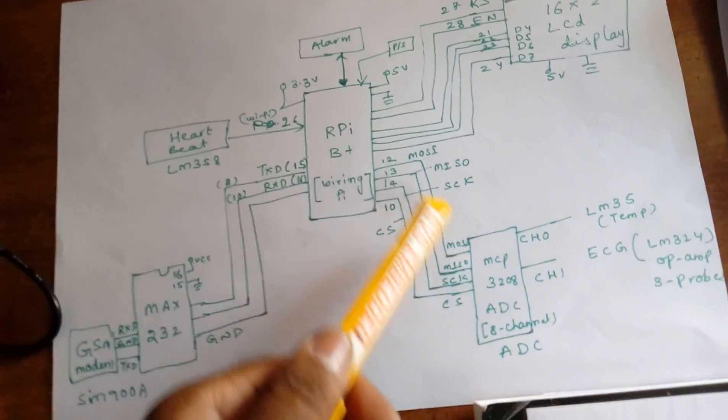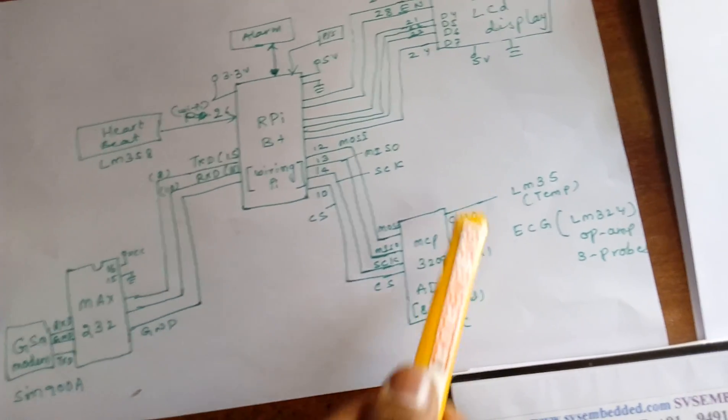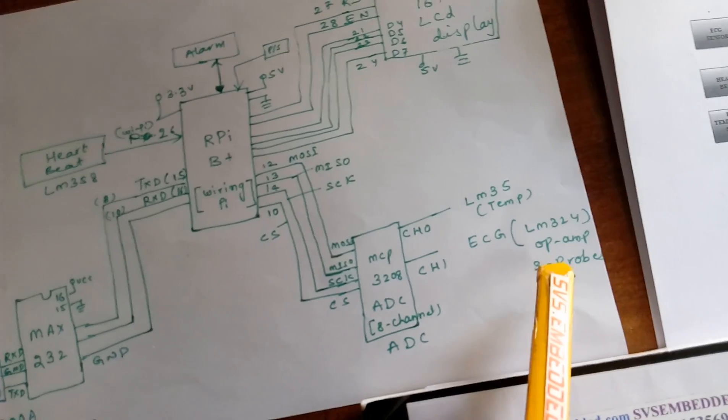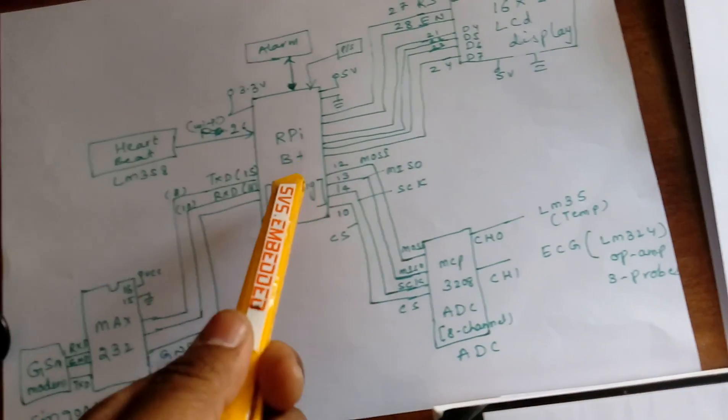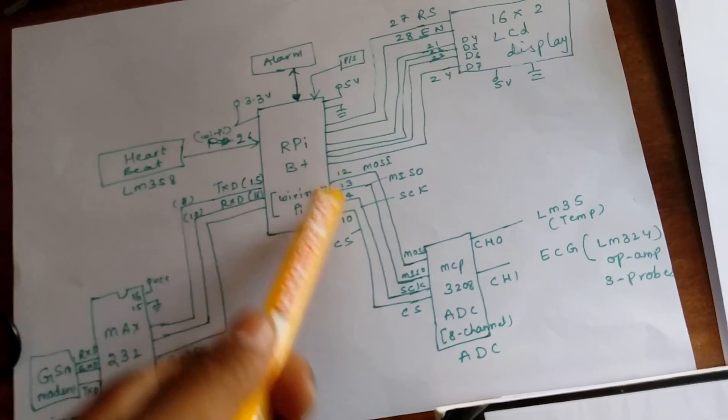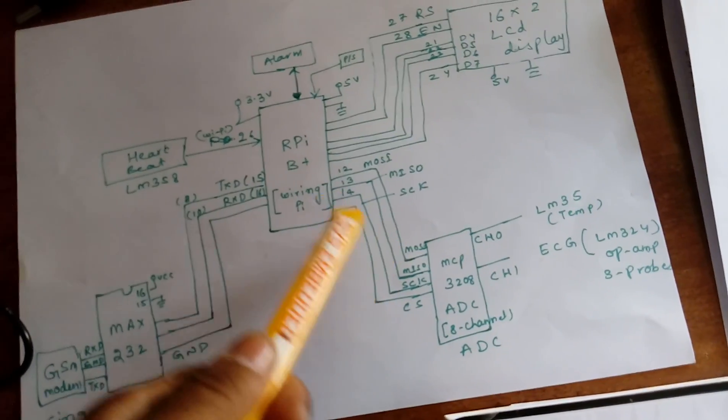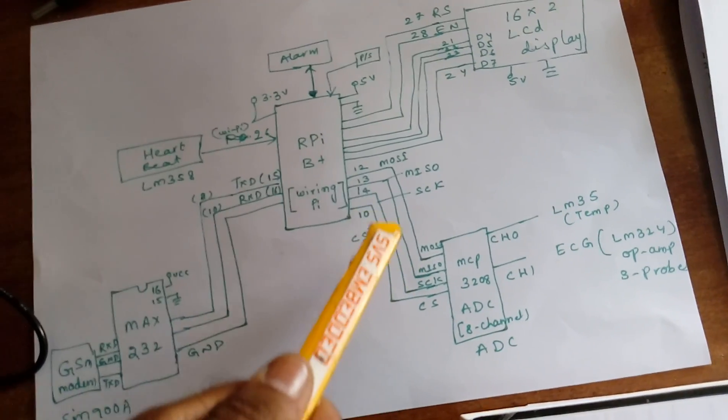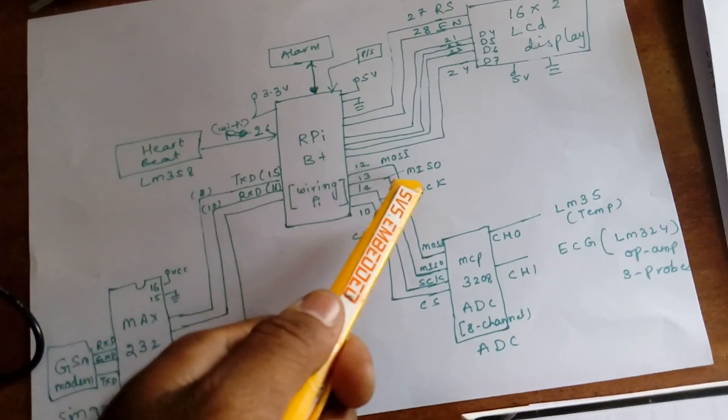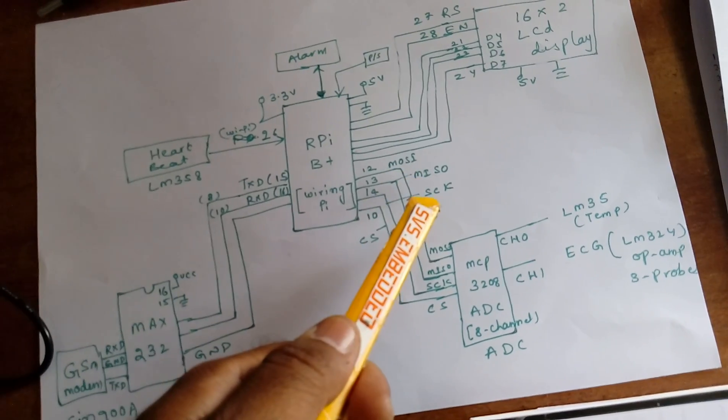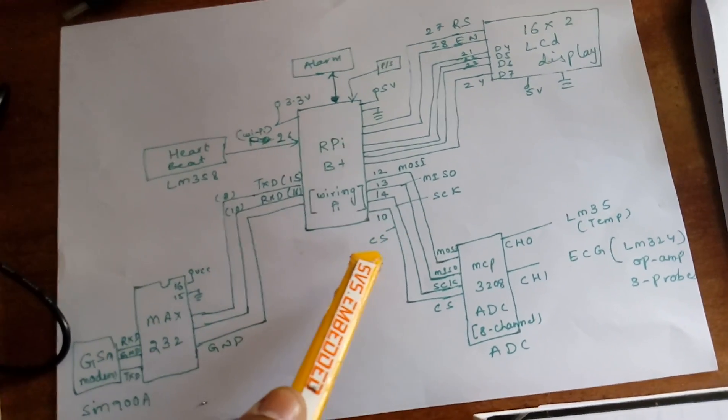So let us go into the schematic diagram. The MCP3208 ADC, LM35, and ECG are connected to the SPI protocol: MOSI, MISO, SCK, and chip select.